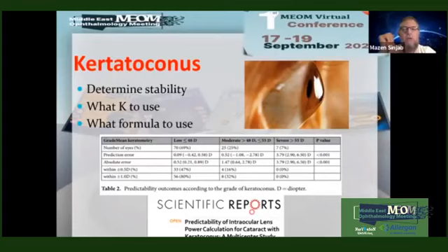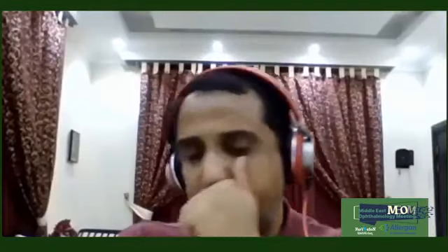We have to go for more than one formula, okay? And then, of course, we have to counsel the patient and tell the patient that it is an estimation rather than calculation of the IOL. So it is an estimation, and maybe there will be some mistakes in the calculation.